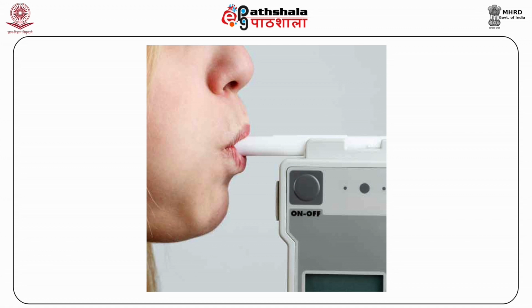When the valve is in the intake position, the subject is made to blow into a mouthpiece, which is coupled with a metal cylinder. As the subject blows, the pressure of the exhaled alveolar breath raises the piston to a height so that it exposes the two vent holes near the top of a heated cylinder and covers them, trapping the last portion of the air in the cylinder.